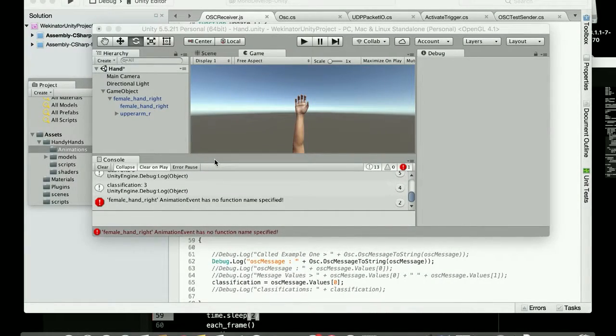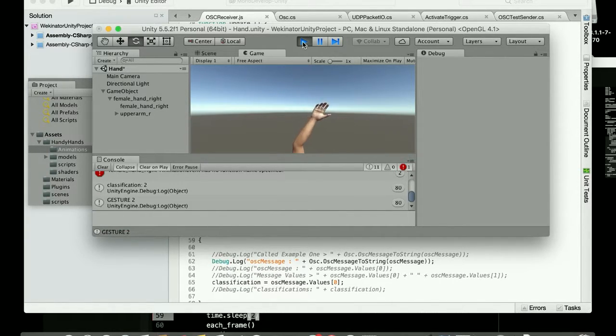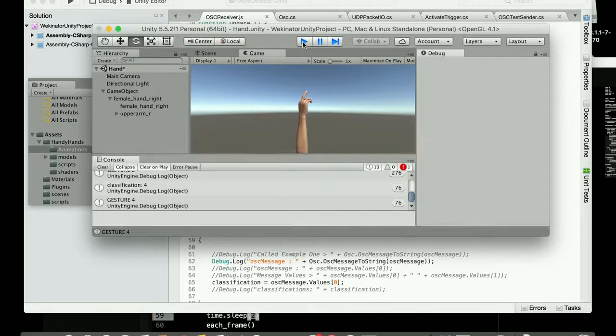When filming the first part of the video, you couldn't actually see the model, so this is a screencast just to show the actual model working while I give the gestures. I'll go ahead and start it. You should see three different gestures here. First one should be my left hand squeezing. Second one should be my right hand squeezing, and they're getting a little mixed up. And then the third should be my head bending. There we go.